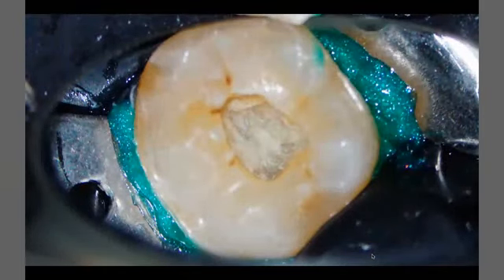So we started as usual with our initial outline with the rubber dam. In this stage of access, you have to take multiple periapical X-rays to check clearly that you are centered and you are not going beyond the floor. You are not going very deep. Because if you go deep about 1 millimeter and you start going mesially, distally, buccally, lingually, as usual, you will lose the floor map, which is the most important thing to guide us back to the root canal orifices.